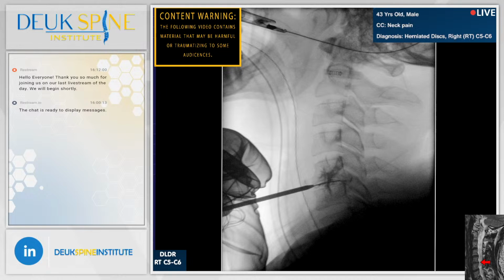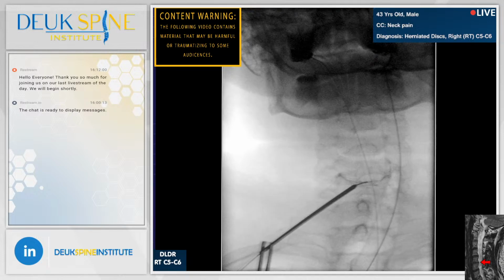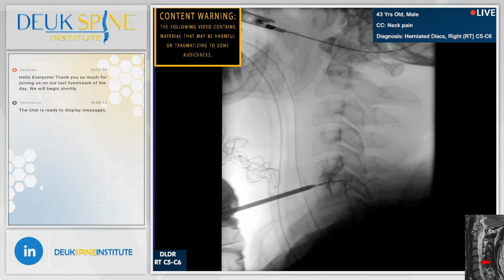We're going to verify with our x-ray that indeed we are in the right spot. You want to enter the front of the disc as midline as possible. That looks really good. We're just to the right of midline, a hair, literally about 2 millimeters, so it's perfect. Very happy with that. And lateral.